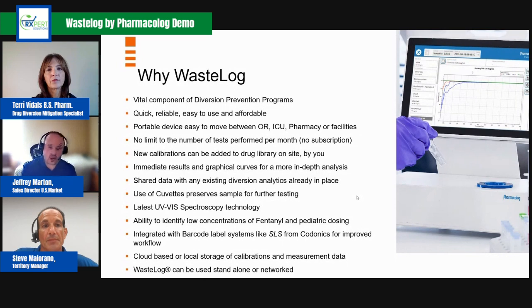So why Wastelog? Wastelog is a vital component of diversion prevention programs. It's quick, reliable, easy to use, and affordable. It's a portable device. It's easy to move between OR, ICU, pharmacy, or facilities. There's no limit to the number of tests performed per month, so there's no subscription. The new calibrations can be added to the drug library on site by you in under 3 minutes, so it's very quick. You get immediate results and graphical curves for more in-depth analysis.